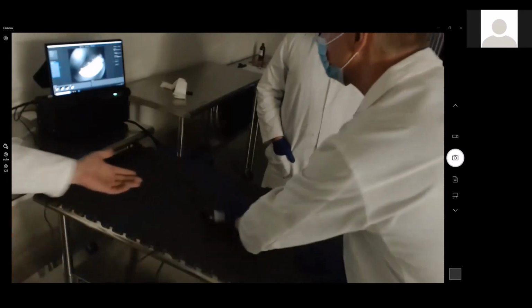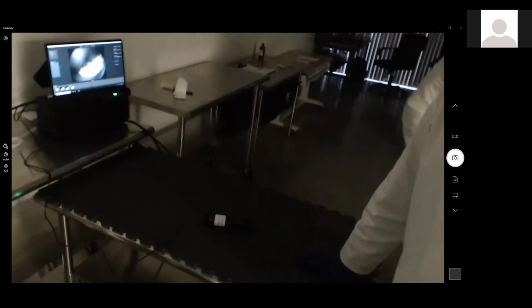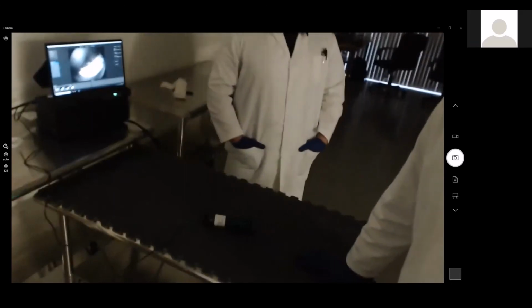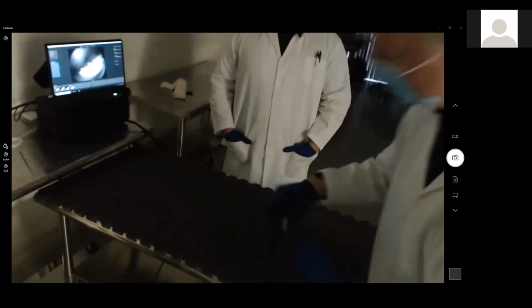And I can say we've put this on our eye and looked in our eyes. I know I have in my eye as well, and it's very bright. It's a little hard to get around at first. So I would think in terms of developing a handheld fundoscope, Jill, you chime in here. I would say this thing is currently using.